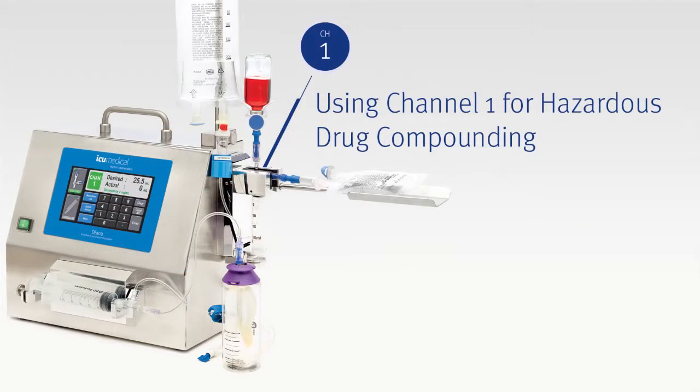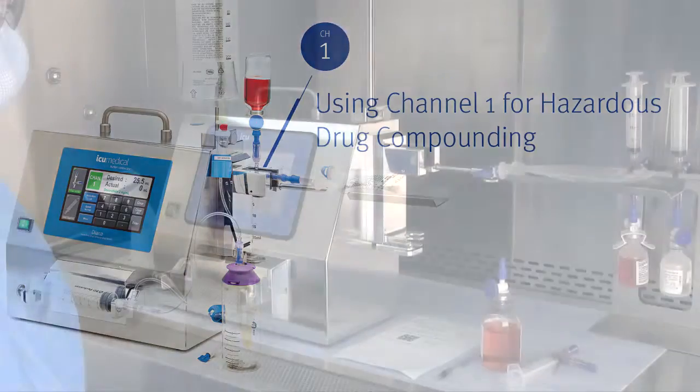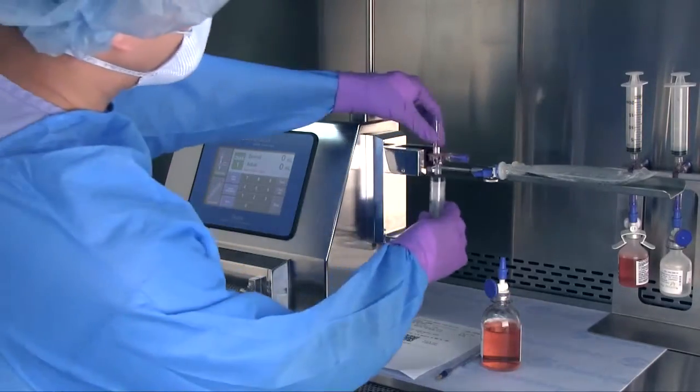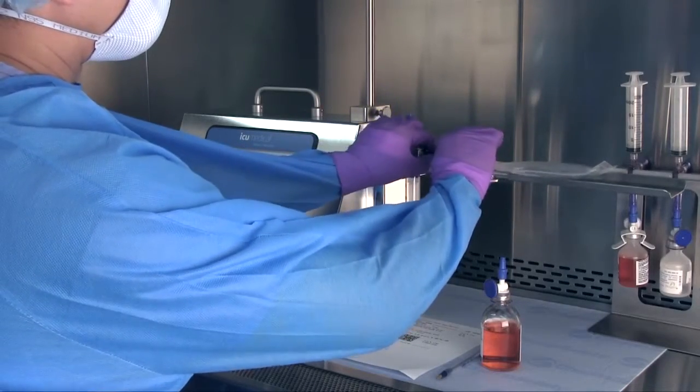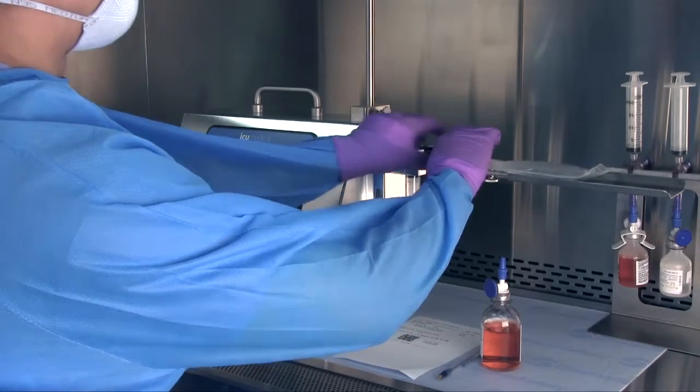We'll start by showing you how Diana's Channel 1 can be used for hazardous drug compounding. To begin, click the Diana syringe and cassette into place and attach a patient container — in this case an IV bag — to the end of the cassette.